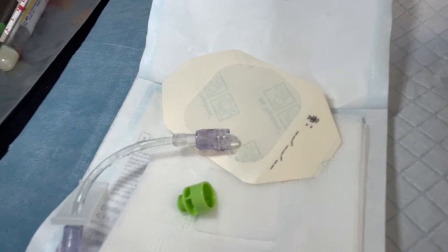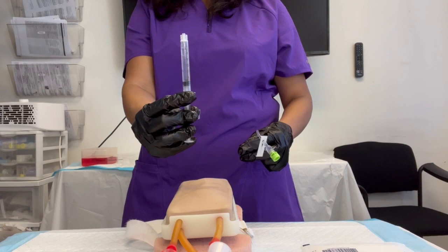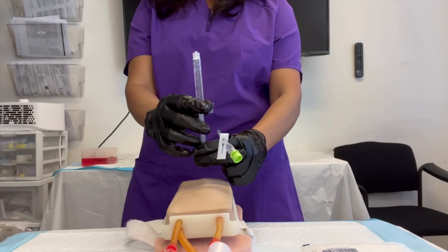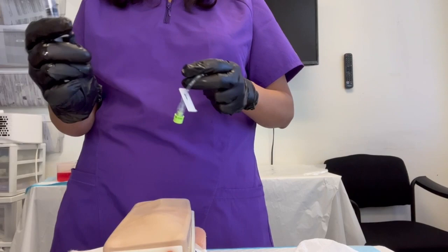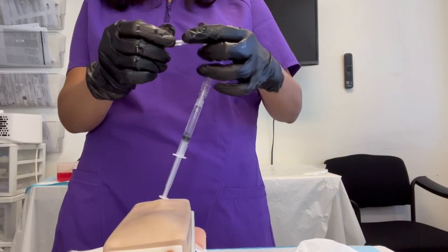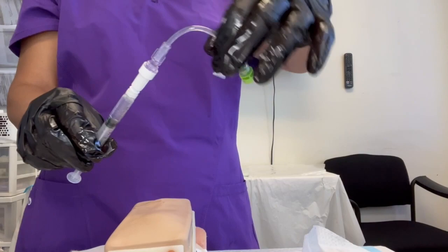Grab your saline and take it out of the packaging. To get rid of bubbles, keep the syringe vertical and aspirate all the way down, then flick the bubbles. Make sure all the bubbles are up front so you can plunge them out. Remember, don't touch the tip or you break sterility. Then lower and lock it. If your cap is too tight, just loosen it but don't take it out. It should look like this — no bubbles in the syringe.